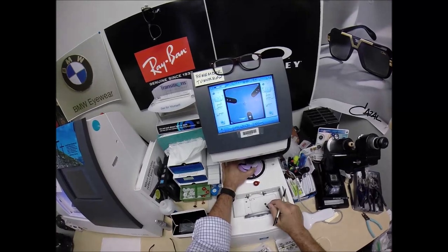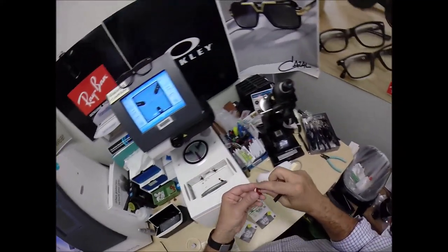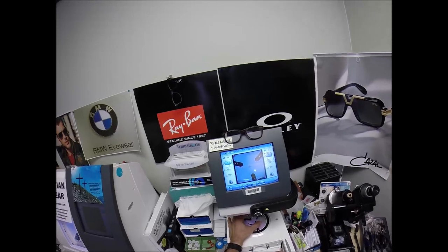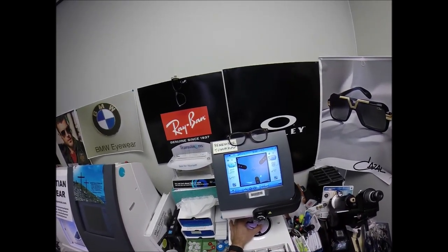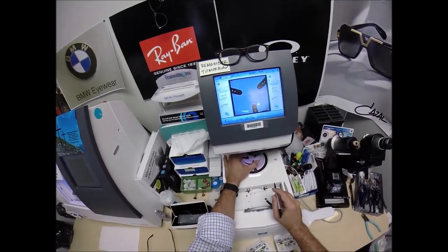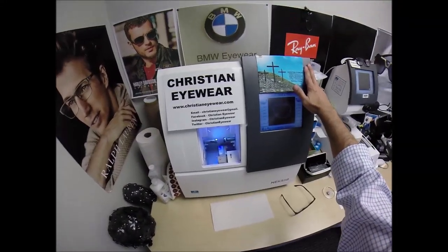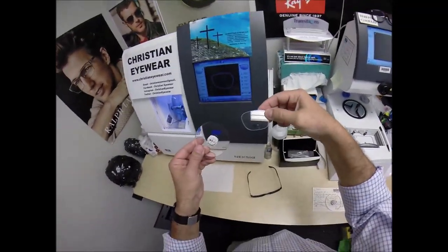Hit that button — the arm is going to come down and place the block onto the right lens. We're going to do the same thing now for the left lens. Pull the paper away to make the black side sticky. Line up the magnet. Grab the left lens, put it on the platform. Same PD, same optical center height, get everything lined up perfectly. Hit that button — the arm comes down and places the block onto the left lens. Now, this is the blocker, this is the tracer, and this is what's known as the edger — this is what's going to cut your lenses down from this size to this size.